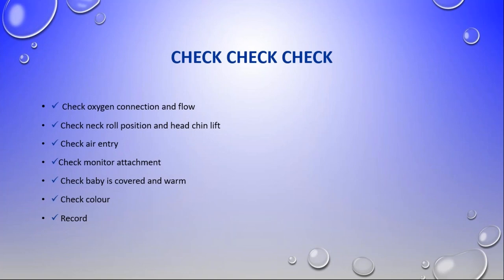Check the monitor attachments. Very often people go, "There's no saturation," and then the sat probes have come off. Keep the baby covered and warm. Check the color and record.